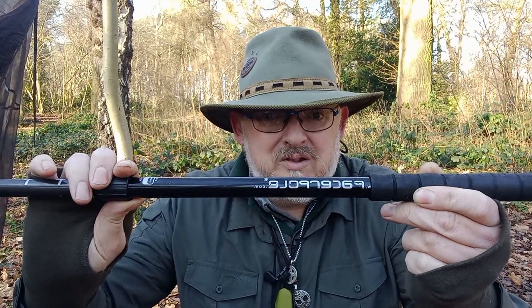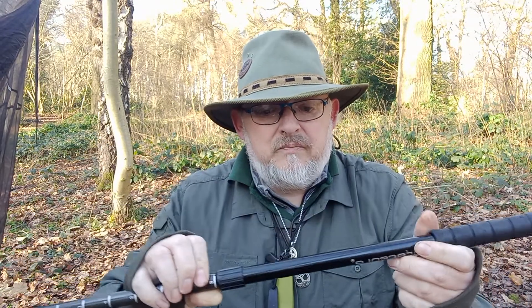These are not your normal walking poles with the straight handles that you see in most shops like Millets and Blacks. These are from a small cottage industry, I think up in the Cumbria way. The lady who designed them designed them to help with posture — she was an OT. These poles I'm going to show you are called PacerPoles.